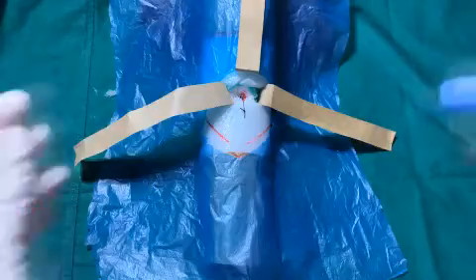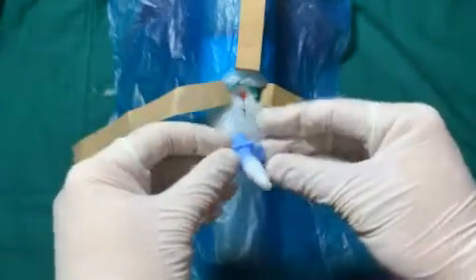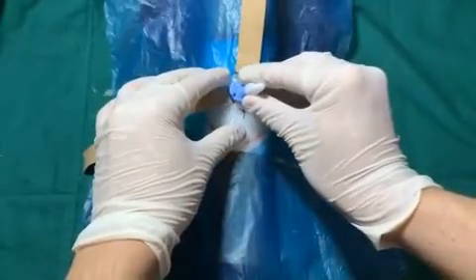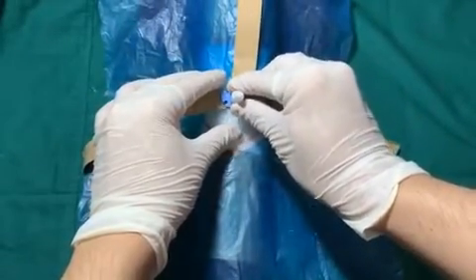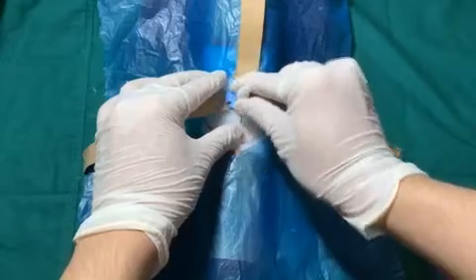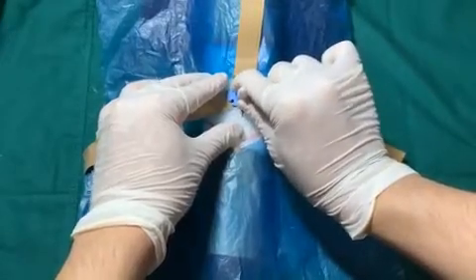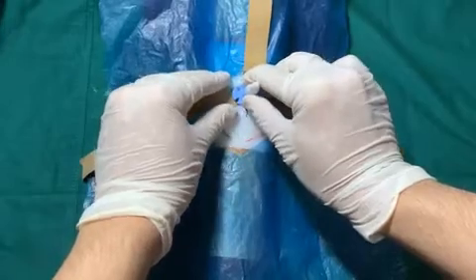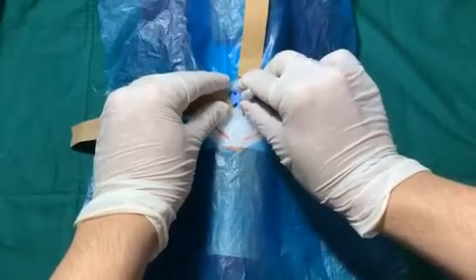Assess the size of the trachea and select the largest cuff tracheostomy tube that can comfortably fit the tracheal wound. Inject air to the inflatable cuff of the tracheostomy tube to test its integrity. Insert the tracheostomy tube under direct vision while applying traction to the suture attached to the tracheal flap.